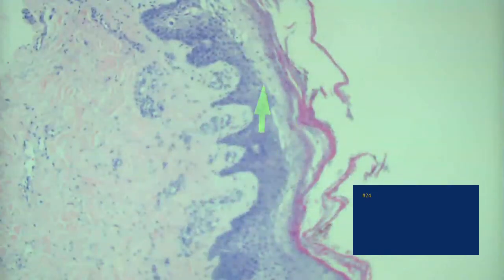What else can you do to this other than that? That was the first thing I thought of, and then I moved very quickly. As far as what else can give you just a pale epidermis, other things that I think of when looking at color change, this doesn't fit great, but epidermodysplasia verruciformis can give you that pale blue. Anything that's got any kind of necrosis and re-epithelialization of the epidermis could do something similar. Maybe some kind of irritant reaction, which also sometimes gives you a little bit of irritation. So acute spongiotic dermatitis causing vesicular change, maybe? That'd be a little less likely to give you this part. But let's say they applied some kind of irritant to it. That could give you this.